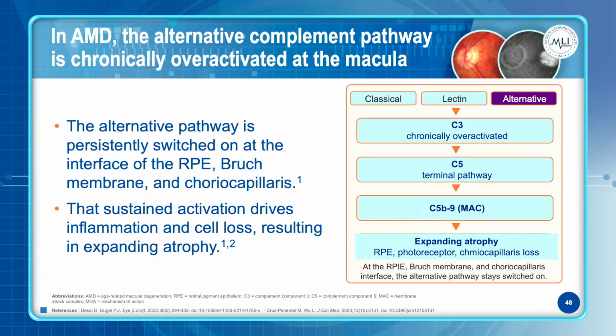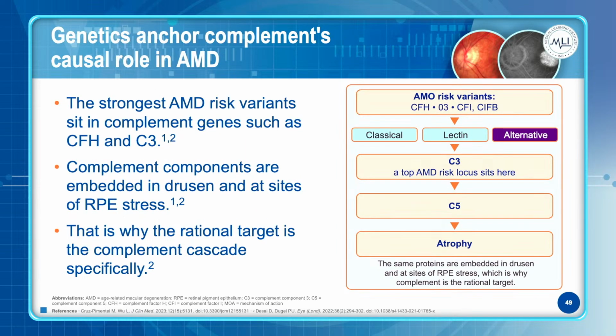And Glenn kind of covered the biomarker we are looking at, hyperautofluorescence at the edges. You have the banded and the trickling. So the complement system is very active in overdrive in some patients, and we can actually see on imaging biomarkers which patients are going to be fast progressors.